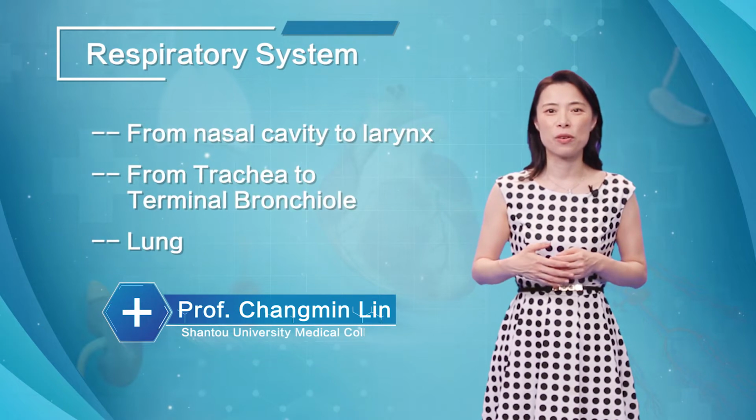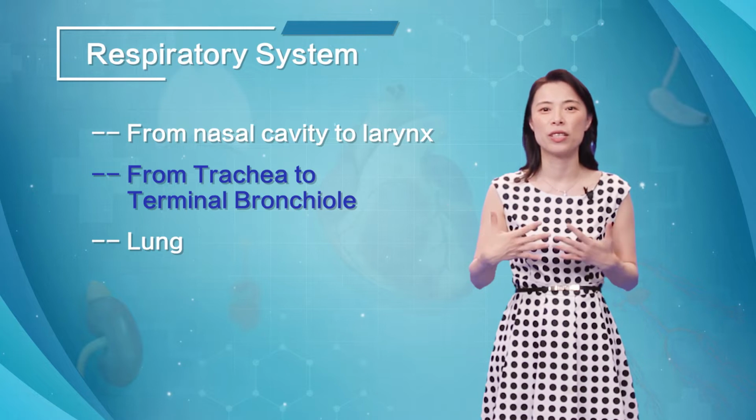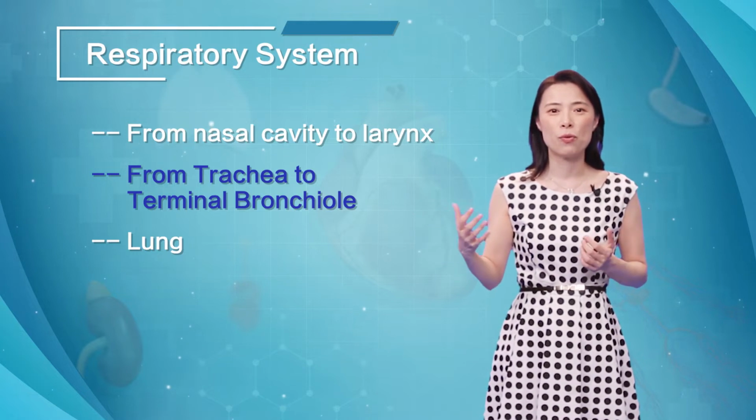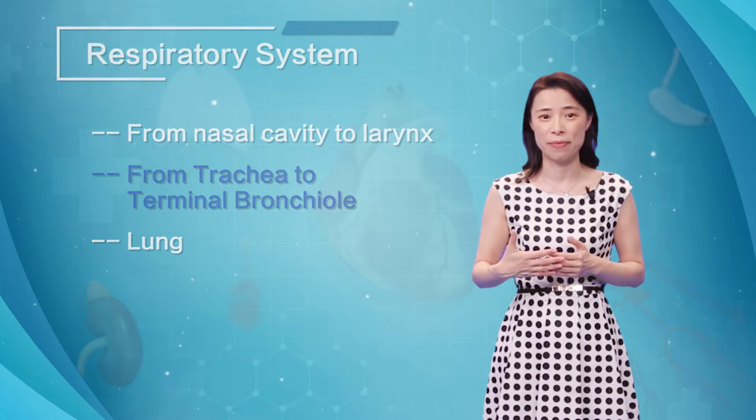Today's sections will be from the trachea to the bronchioles and finally to the terminal bronchiole, which ends the conducting portion of the respiratory system. Again, we will start with Huchi's case.